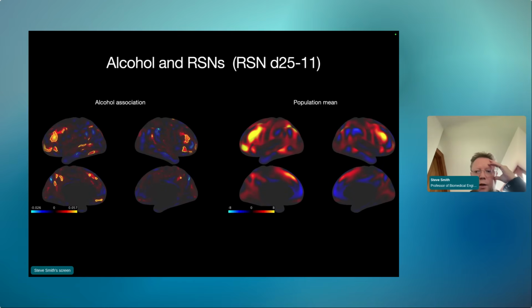For the fMRI, the processing that we do in our core processing pipeline that Fidel Almagro runs on behalf of Biobank, all of the fMRI is run on the cortical surface, a representation called GIFTI, unlike the other 3D modalities that I had been talking about so far. So in the resting state, this is one of the resting state maps. You can see on the right the representation of the population average. This is just for visualization, but those averages are included in Pandora. On the left, you can see the particular Pandora result, which is correlating that resting state network with alcohol.